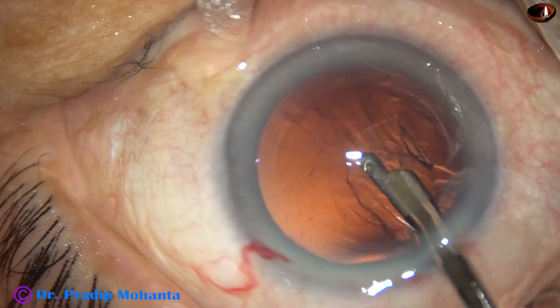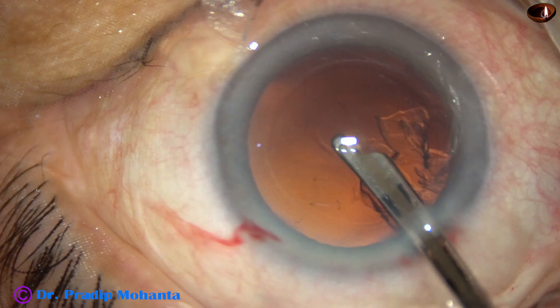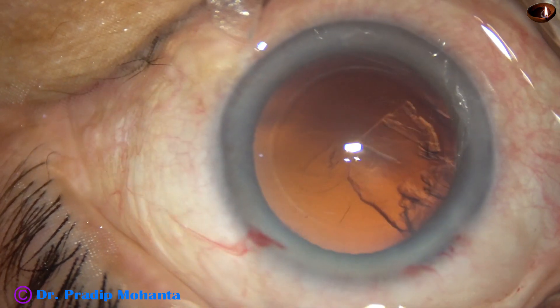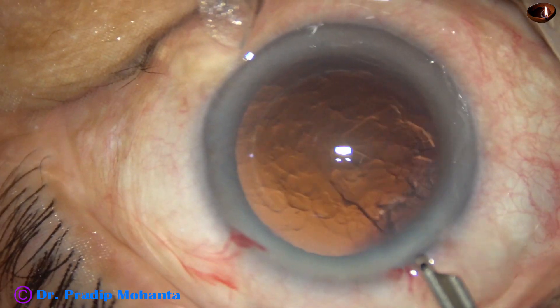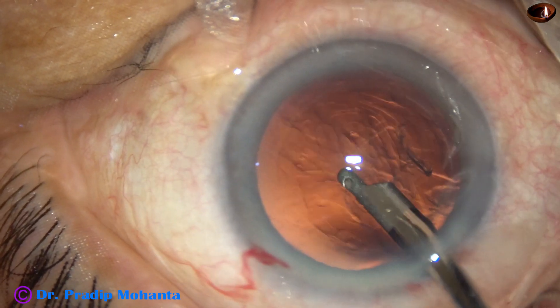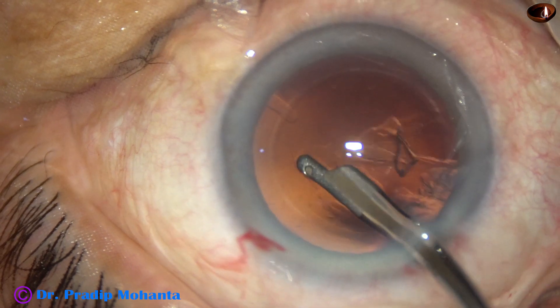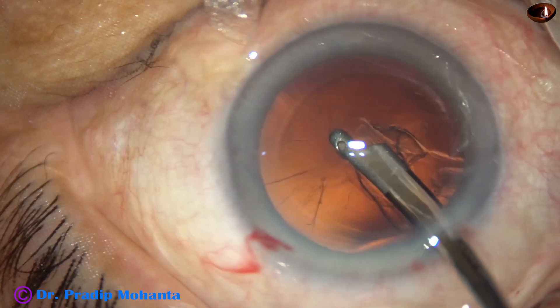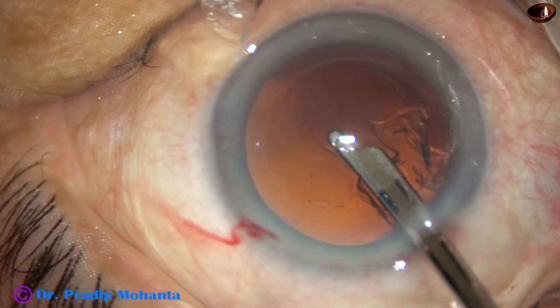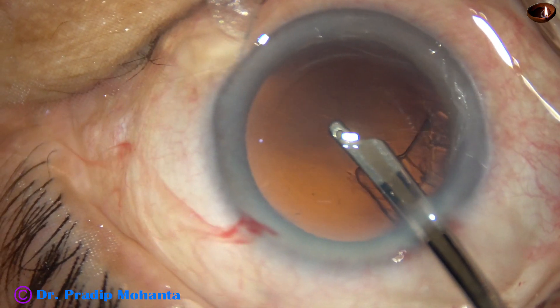Before I remove that, I see what I have done — I have made a rent by the Simco. I tried to polish some cells there. Watch in slow motion: aspirating the visco, I see some cells there. I try to remove the cells by the Simco and there is a rent. This is a small rent and I have to manage it from now.